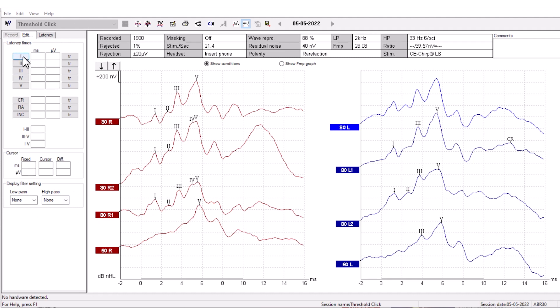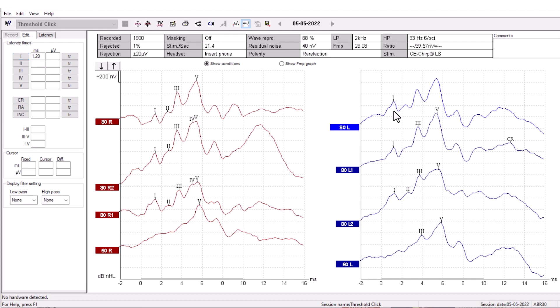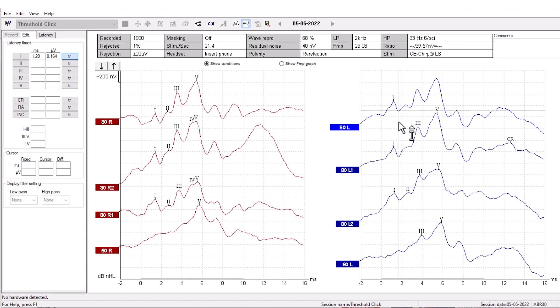In the Edit tab, you can mark your waveforms and label them. If you want to mark wave 1, press 1. When placed, you can see the latencies in milliseconds. If you also place the trough at the bottom next to the peak, you will also see the amplitude of wave 1.